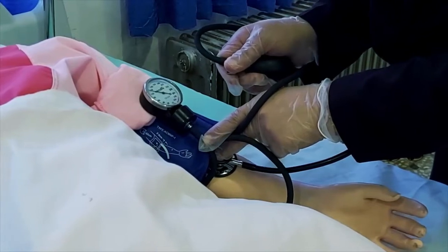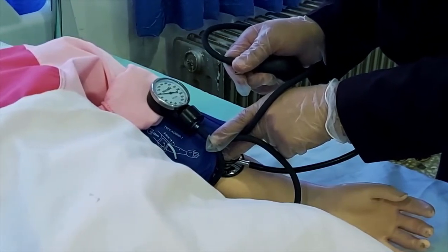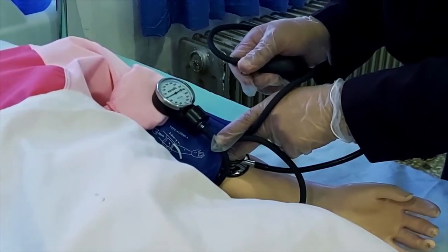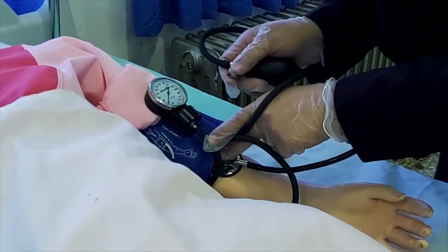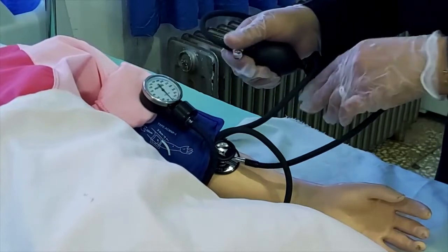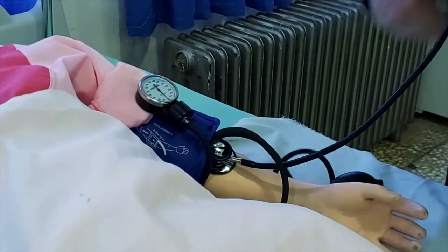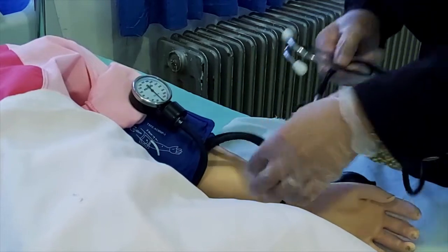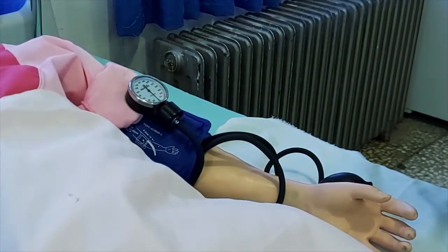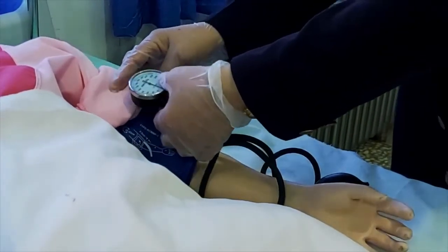اولین صدایی که شنیده می‌شود، فشار سیستول است. تخلیه را ادامه می‌دهیم تا جایی که صدا قطع می‌شود؛ اینجا فشار دیاستول را نشان می‌دهد. پیچ را کامل باز می‌کنیم و کاف را از هوا تخلیه می‌کنیم. گوشی را برمی‌داریم و کاف فشارسنج را از بازوی بیمار باز می‌کنیم.